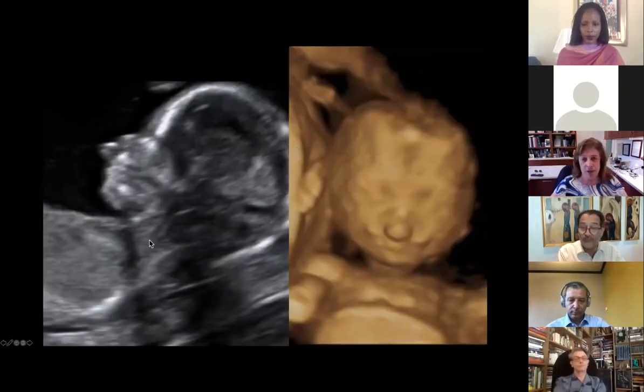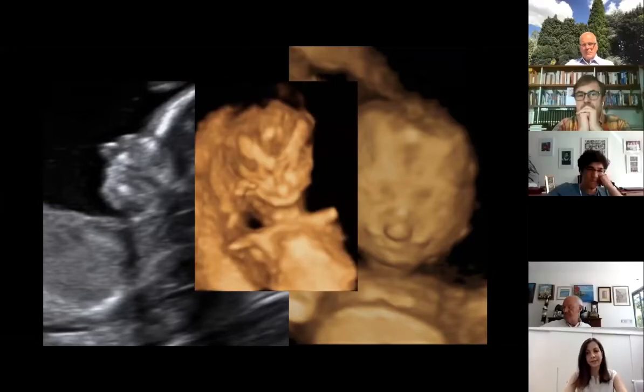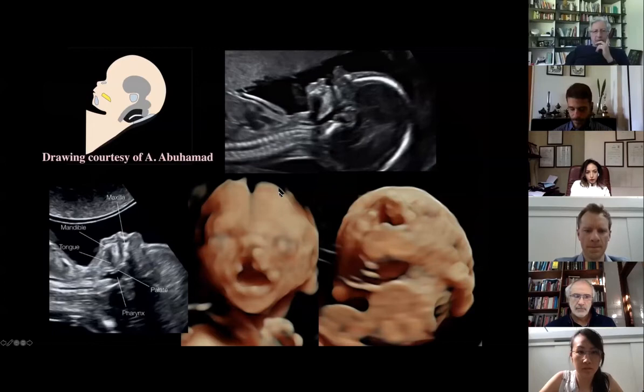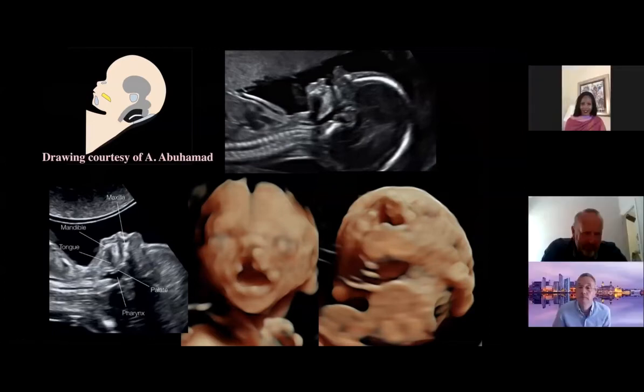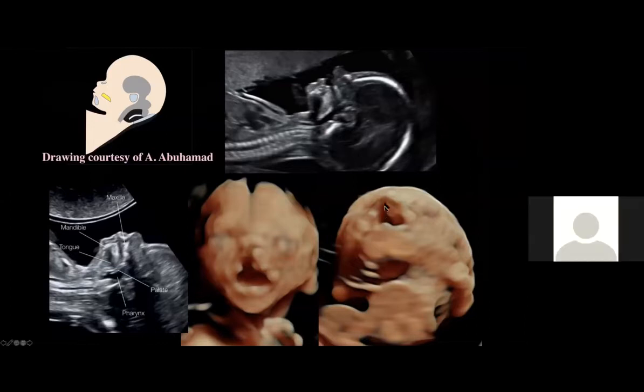And as we looked into it a little further, of course, you can see that it's a bilateral cleft lip and palate. And you can see that because the 2 seams are off, it makes a mass that protrudes anteriorly from the face. You can see here as well. So when you're lucky enough to have the fetus open its mouth, you can actually look into its mouth and see the cleft going all the way back, not only through the lip, but also through the entire palate, and you can see the failure of the palate to form in the front here.